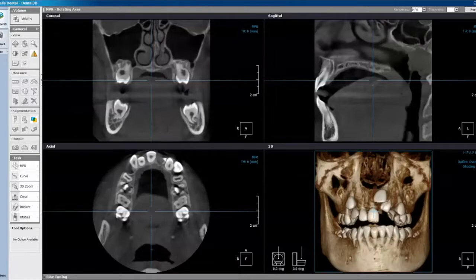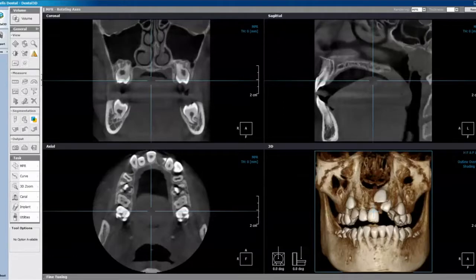Hello, this is Dr. Jeff Brooks at the University of Tennessee oral maxillofacial surgery department. For the next couple of minutes I'm going to demonstrate how to create a panoramic curve. There are several ways to do this and I'm going to review a couple of the ways that are most commonly used, and hope that this will help improve your workflow through this software.